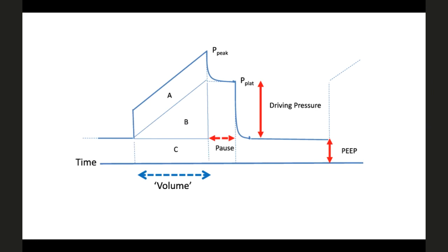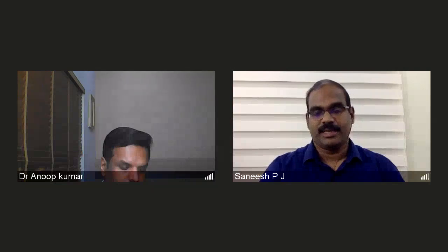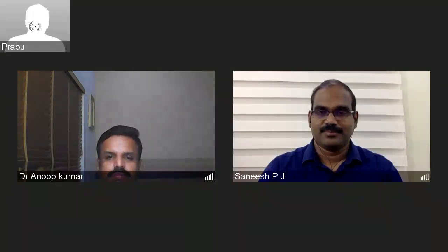We'll discuss it further when we discuss lung protective ventilation, because plateau pressure minus PEEP is the driving pressure. That is the pressure with which you inflate the lung units. How much the driving pressure should be, we'll discuss along with the lung protective ventilation strategies. I think, Dr. Rejoy, your doubt is clear. Yes, sir.